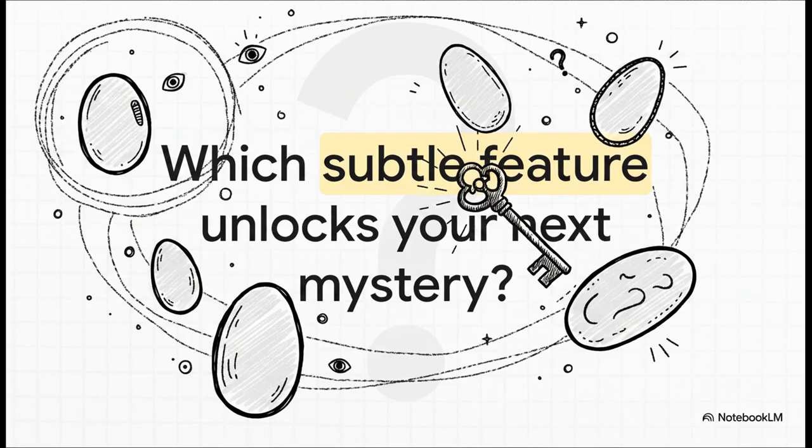I'll leave you to ponder this. The next time a really challenging specimen crosses your desk, which of these subtle diagnostic details will be the master key to cracking your next microscopic mystery?